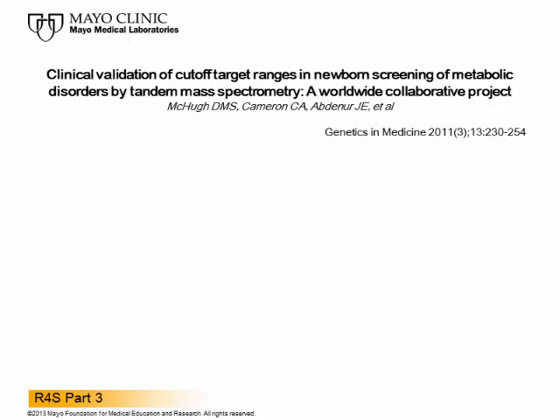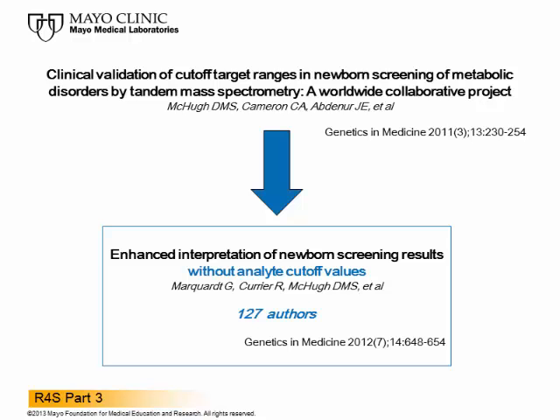For this reason, it became a priority to explore ways to rely more on the power of pattern recognition and profile interpretation of complex metabolic profiles rather than depending on cutoff values, even when their clinical validation had been accomplished. In this presentation, the content of a second publication of a collaborative project will be illustrated to show how the goal of interpreting newborn screening results without analyte cutoff values could be achieved.